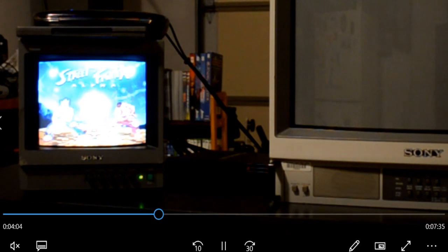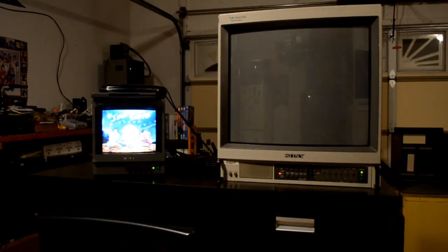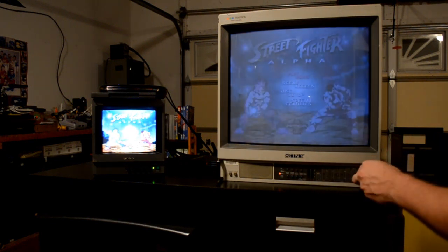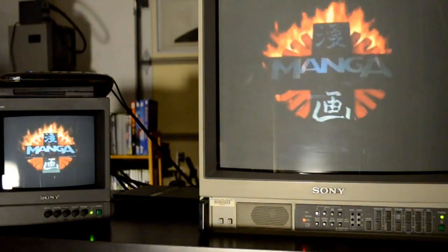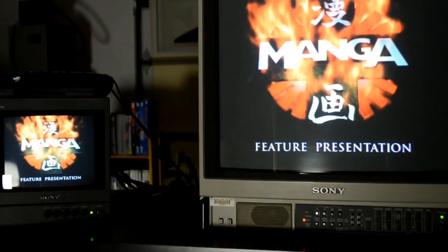So first, I've got a little smaller monitor set up. This is a Sony PVM 8220. And the reason I did that was I wanted to have a composite video test on this monitor. This monitor does do composite, S-video and RGB. But that way, there is no service menu, so I could see if something was going to come up right when I turned it on. So it's always good to have something that you know is working.